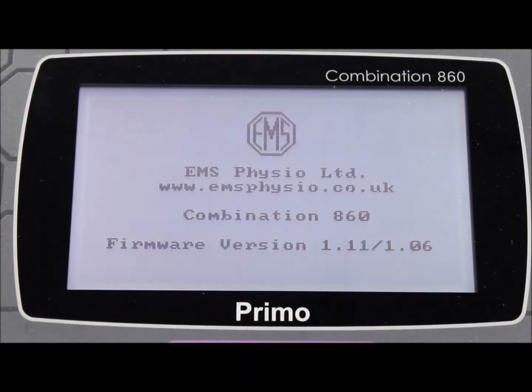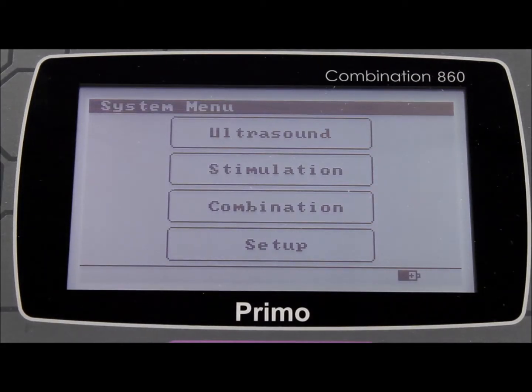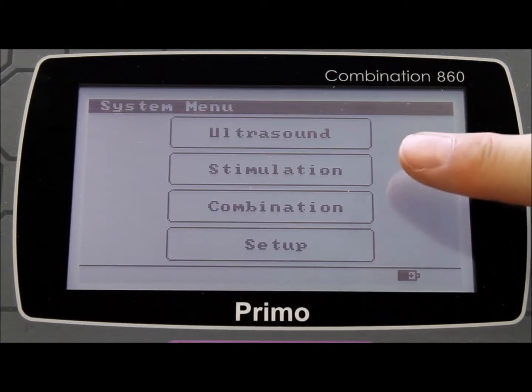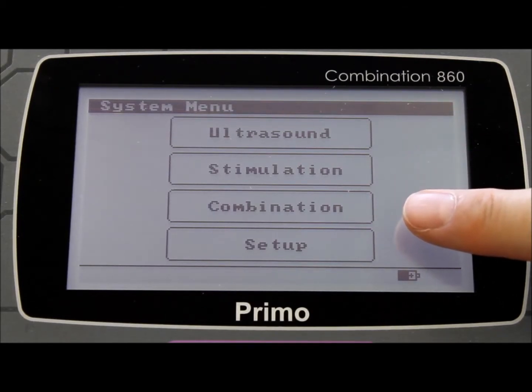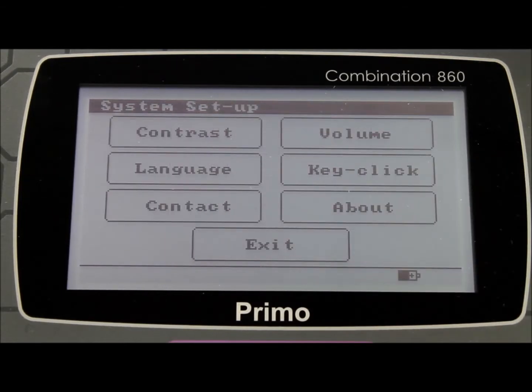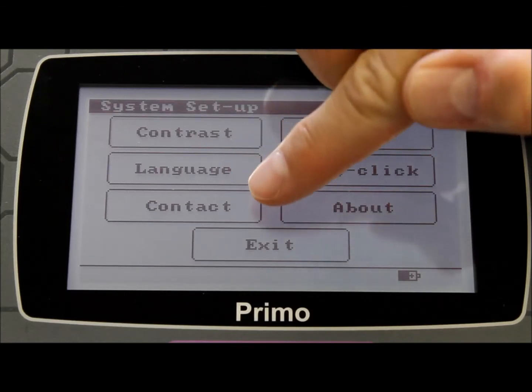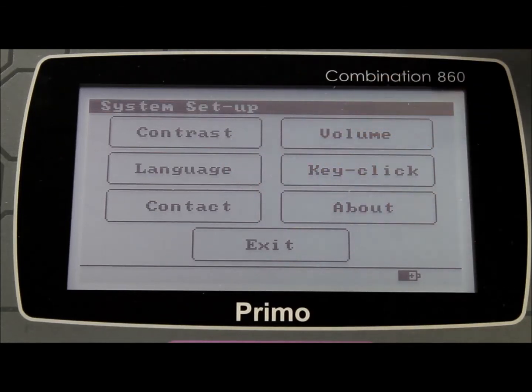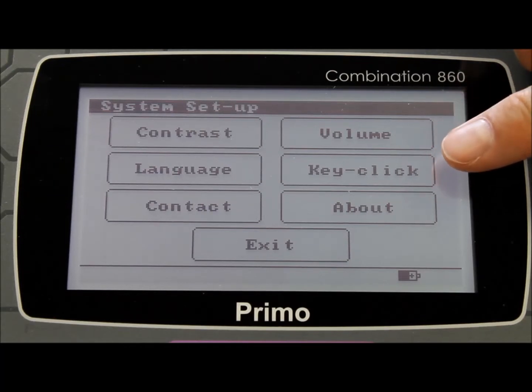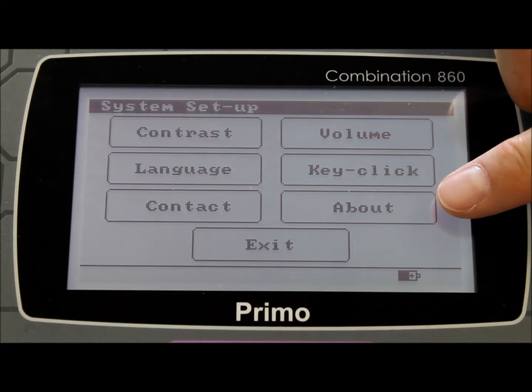When you power up the machine, you can instantly appreciate the clear and intuitive touchscreen display. You can choose between ultrasound only, stimulation only, or a combination of the two. The setup menu allows you to choose your preferences for screen contrast, language, the ultrasound contact alarm management system, audible volume levels, and audible key clicks.